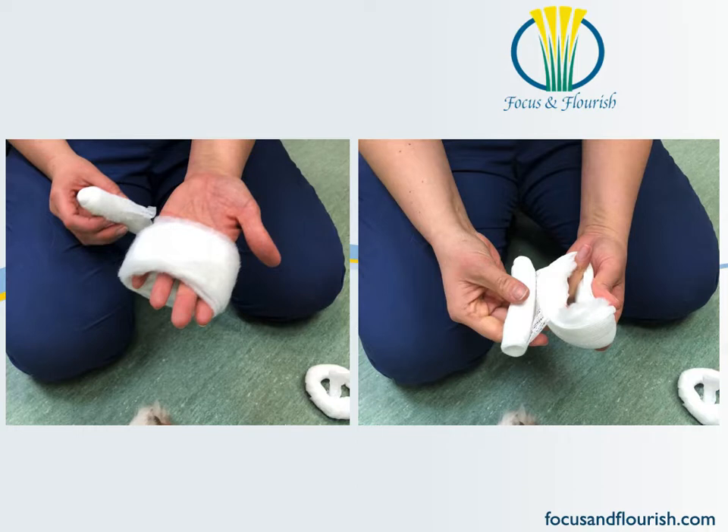Another nice technique that Jennifer likes to use is to start with some cast padding instead of cling. She's wrapping the cast padding around her hand, and now she is going to use cling to start creating the doughnut part of the bandage by going inside the hole and back out and around the original cast padding material itself.